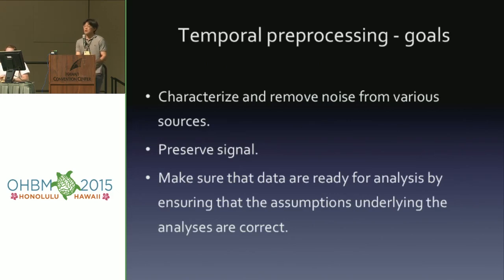Okay, so what are the goals for temporal preprocessing? Just like any other preprocessing tools, the goal is to remove noise while keeping your signal and make your data ready for further statistical analysis.